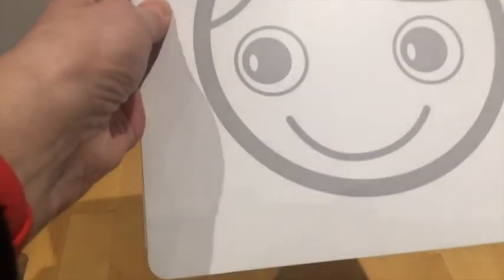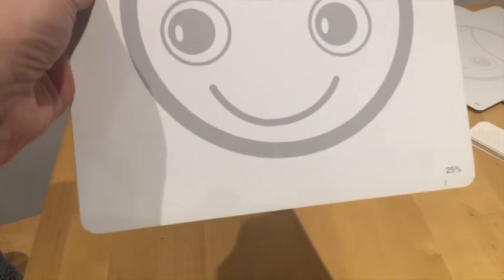We start off with the darkest face. We take our front cover and cover them over, with the blank facing out and the face card against your chest. It is really important when carrying out this assessment that you are wearing something quite plain so that you're not attracting attention with what you're wearing. When you hold them in front of you, the idea is that you are going to pull them apart at the same time.